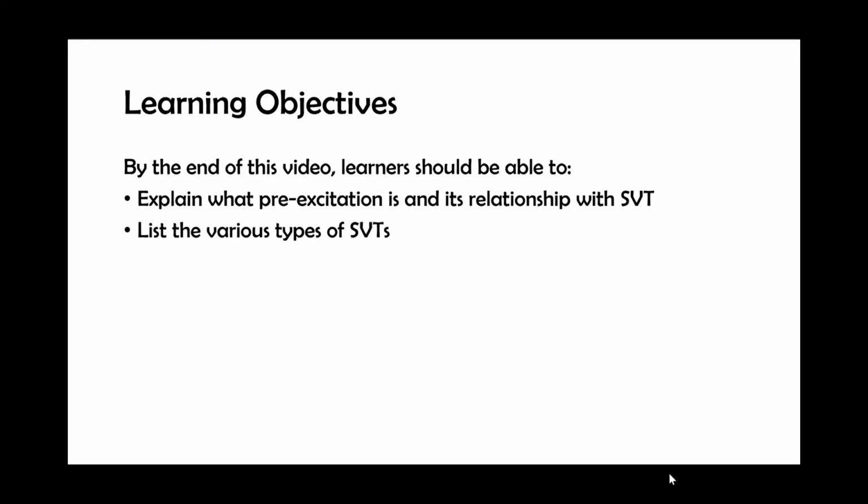Learning objectives for this module: you're going to be able to explain what pre-excitation is and its relationship with SVTs. You'll also be able to list the various types of SVTs that you'll encounter in the clinics or the wards. Let's review the normal conduction system through the heart.